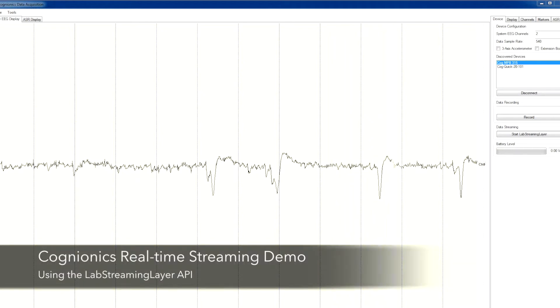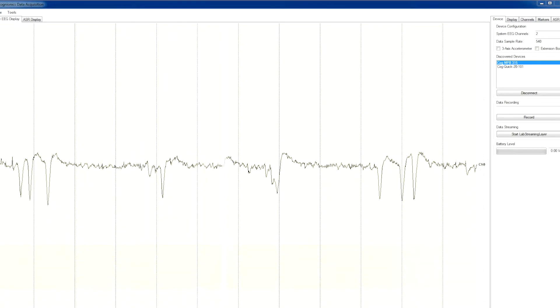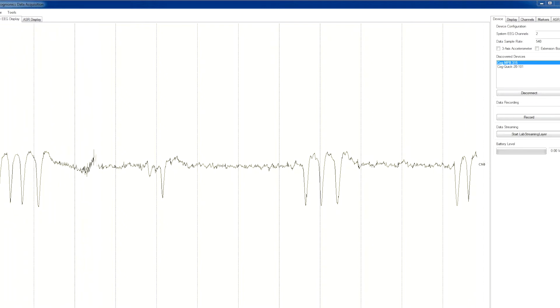This demonstration shows how to access real-time data from a Cognitix system using the Lab Streaming Layer API. Here, we're first displaying the raw data using our acquisition software. Only one EEG channel is used for simplicity.